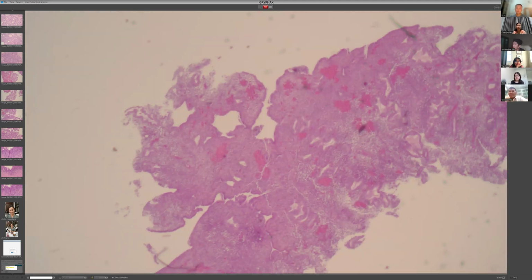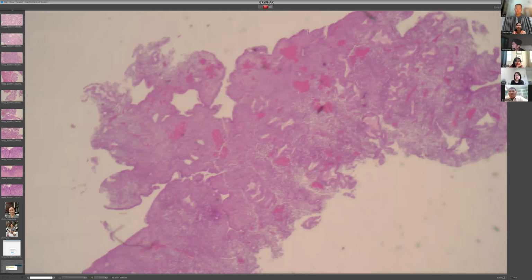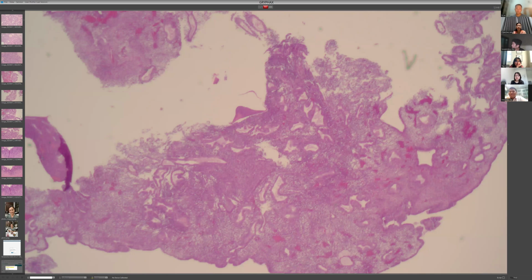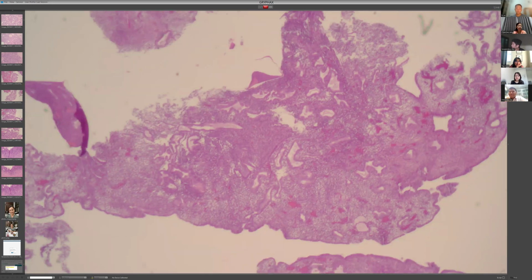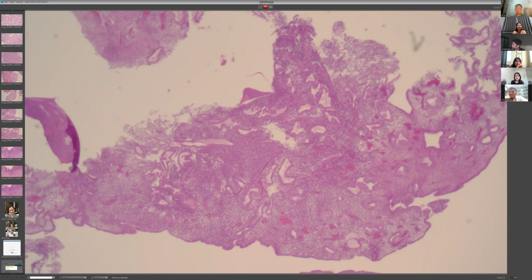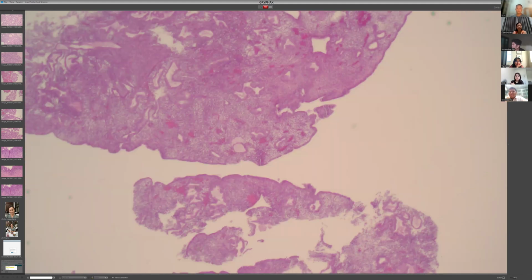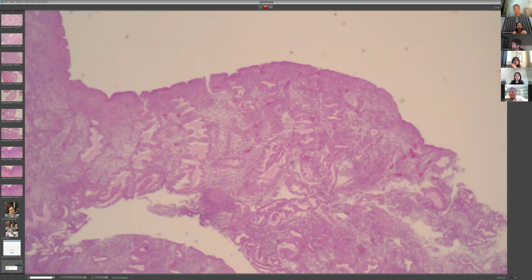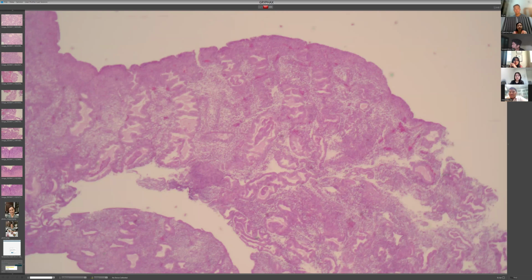I think this specimen is the endometrial curettage. Yes, so it's some kind of curettage. It's not a whole intact surgical specimen because you see strips and fragments. Sometimes you can see the elongated shape of where your curettage tool probably went in.